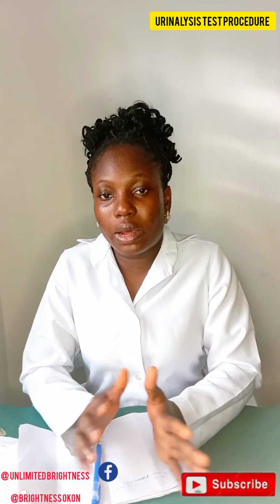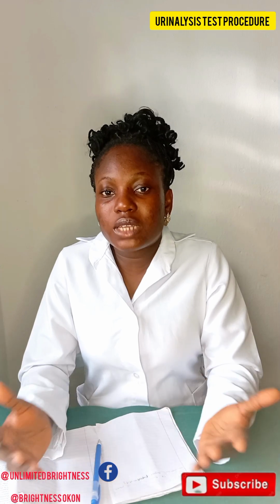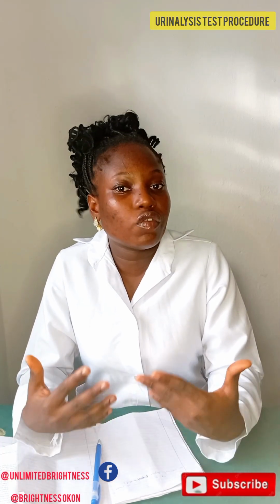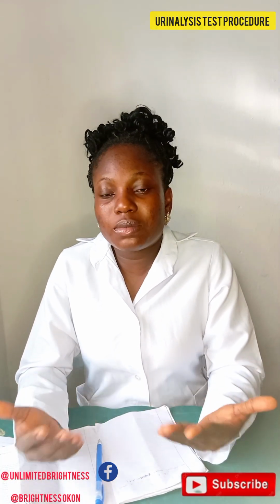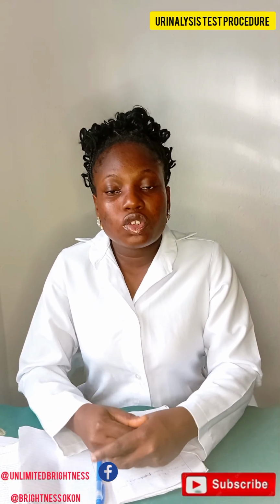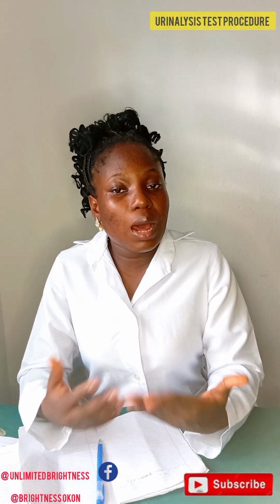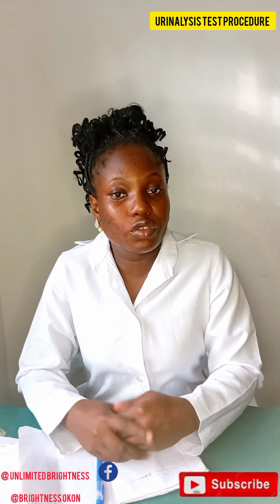The normal color of the urine is amber, sometimes known as a yellowish color. If it is deeper in color, sometimes it can be a function of dehydration, or so many things can cause your urine color to change. So we have different colors such as the deep amber and the amber, which is the normal color of urine.